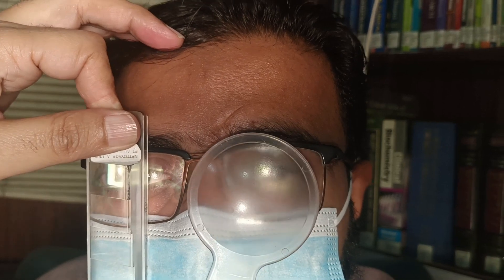Now we want the patient to put his glasses on and repeat the same test to see if the exotropia remains the same. On the cover test you can see a large angle exotropia, and on Hirschberg the light is actually falling on the limbus. An important point: when holding the prism bar, hold it from the edge — students tend to put their thumbprint right on the prism, which smudges it and blurs the view for the patient. If you know it's a large angle, start with a larger prism straight away to save time.